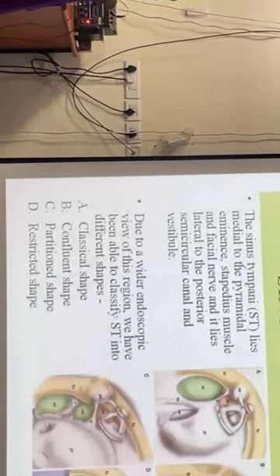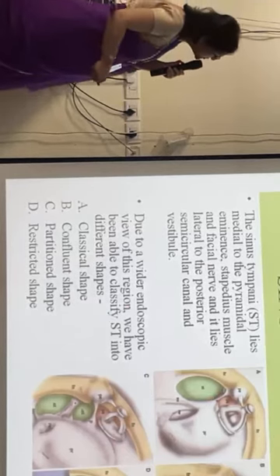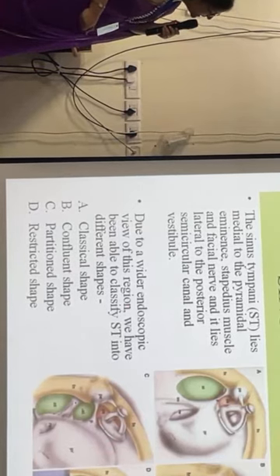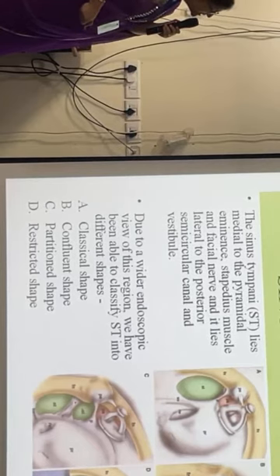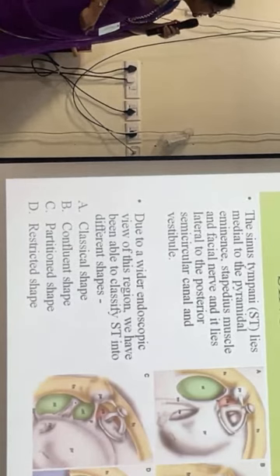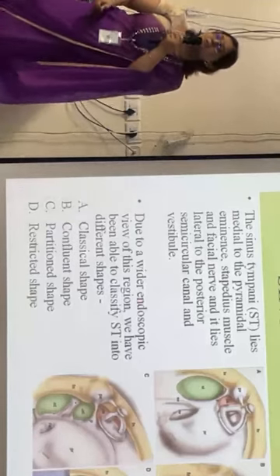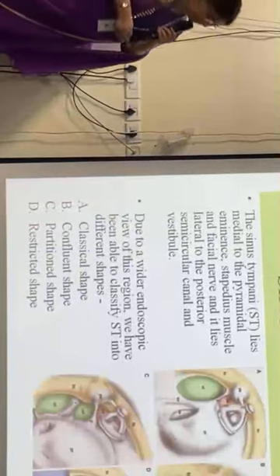We may be able to do this classification only because of the endoscopes. And here, in the last picture, you can see how the sinus tympani is very deep, going posteriorly behind the vertical part of the facial nerve. If we have this kind of sinus tympani with a high jugular bulb, receding behind the vertical part, it is not possible to do the clearance without the use of an angled endoscope.